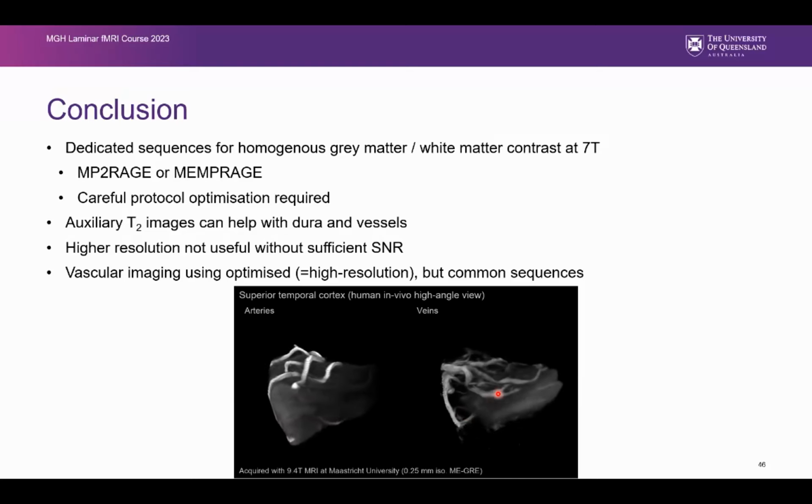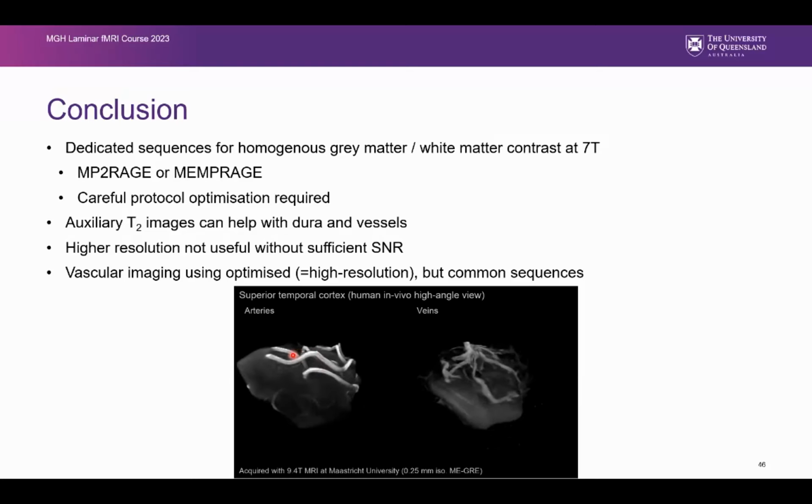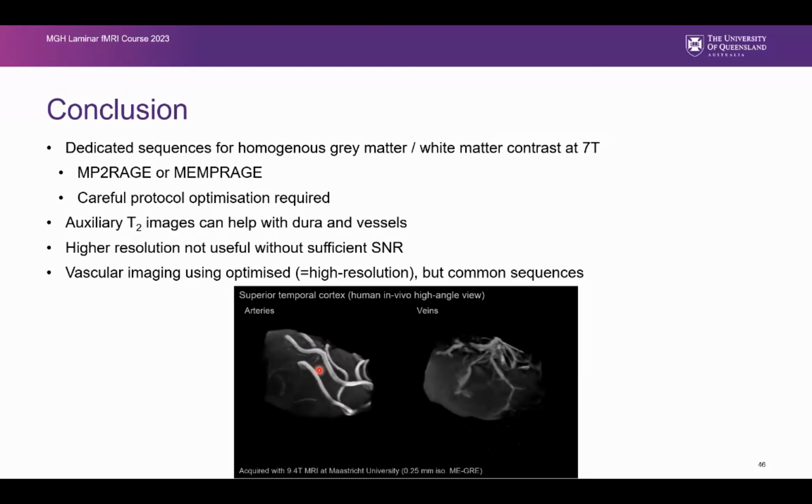But you can see that even then, the arteries look really nice. They're round structures. And the veins are good, but they're not perfect yet. So it's actually, I think, trickier to get a really nice image of a vein. It's very easy to see them because through the BOLD effect, we're actually sensitive to smaller veins than our voxel size because we have these extravascular contributions again.